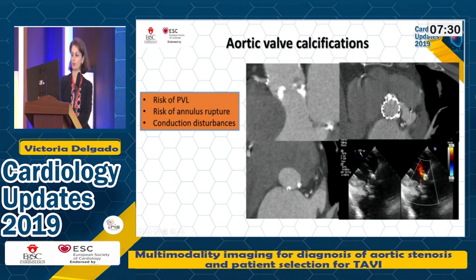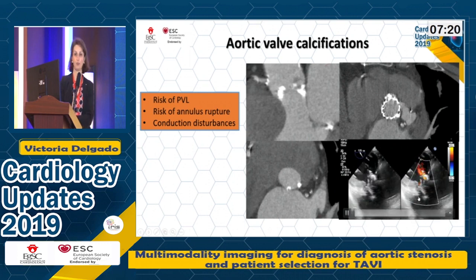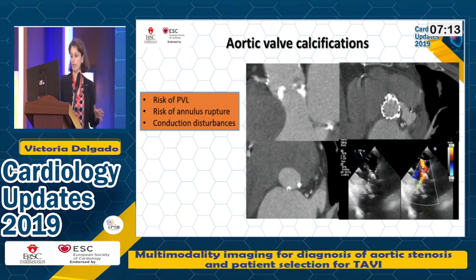This was the calcification that was at baseline, and this is how it was at follow-up. And on transesophageal echo, you can see here the annular rupture with this cavity that we had to treat. In this case, we treated with a valve-in-valve in order to seal the entrance, and the result was good.